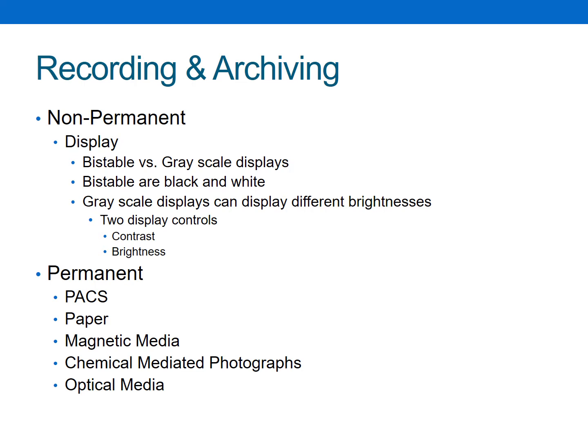Another function of the grayscale displays is that on the actual monitor, you can have 2 controls on there, one being contrast and one being brightness. If you've ever used your menu button on your TV, I'm sure you've seen those 2 options to change how you prefer how that whole screen looks. That has nothing to do with the ultrasounds that are coming back. It has everything to do with what is actually being displayed on the screen. So we can adjust the contrast and the brightness of our display independent of anything going on with our sound waves. So that is a non-permanent form of recording.